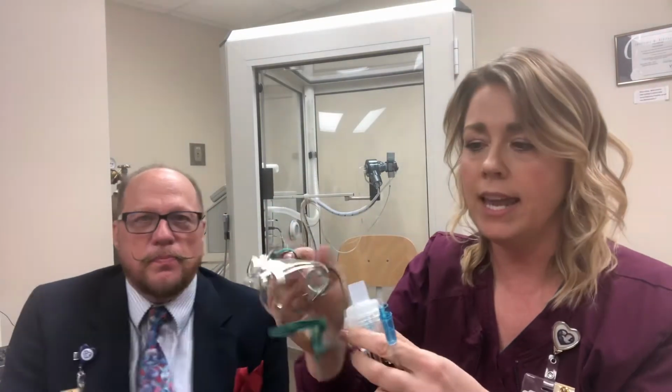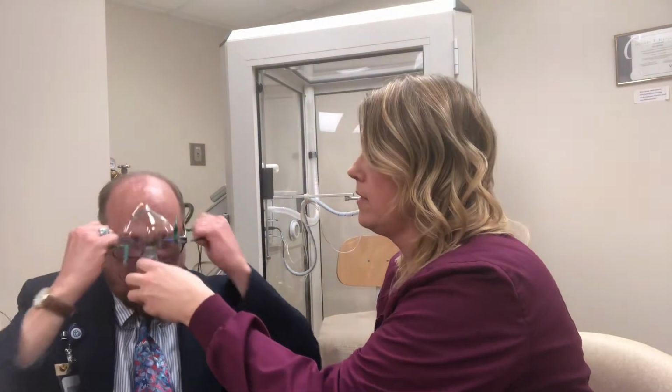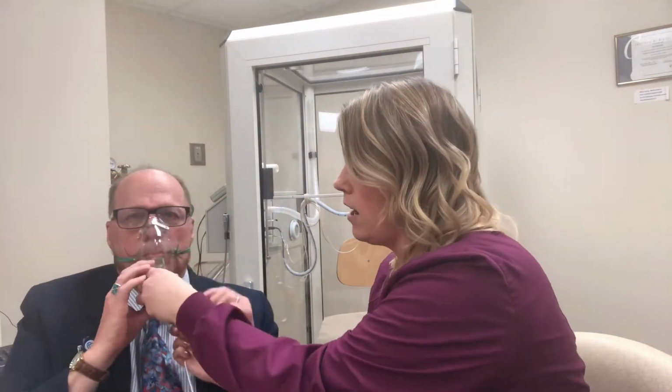Now, if you didn't think they were doing well, they weren't taking a big breath in, or it's a dementia patient, or they just cannot understand what you're saying, now would be a good time to take it off. And you can also stop the drug like this so it's not wasted. And you would put a mask on. Sometimes you know this beforehand. If the RT or the previous nurse had a mask treatment going, then you would already know. And then you would have them put it on.